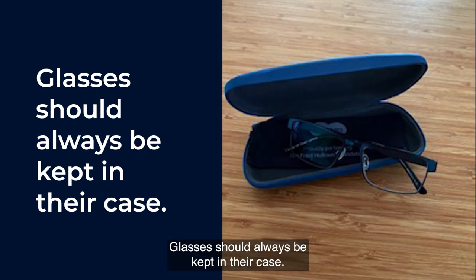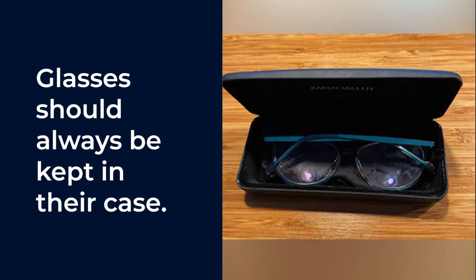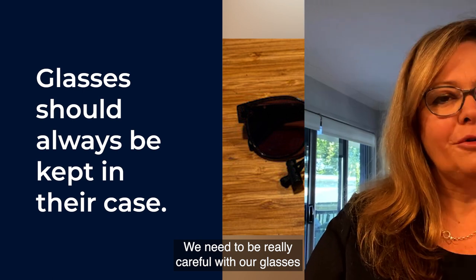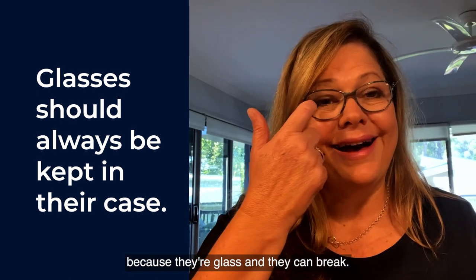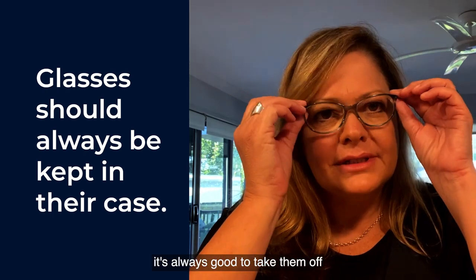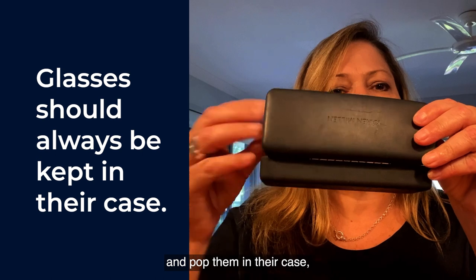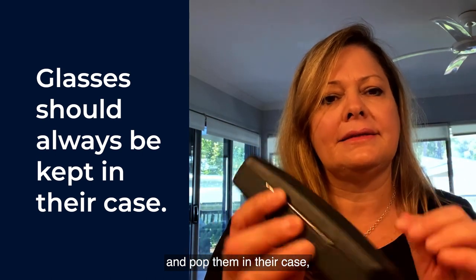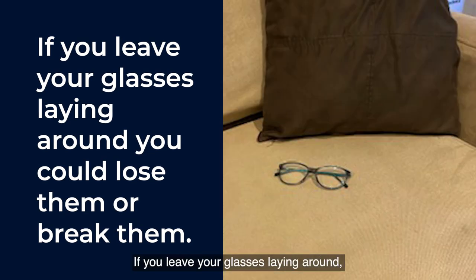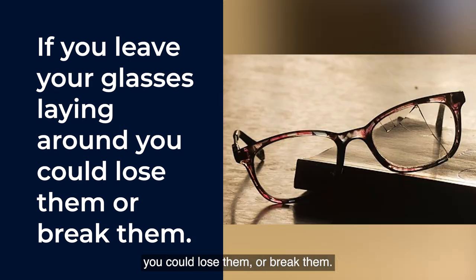Glasses should always be kept in their case. We need to be really careful with our glasses because they're glass and they can break. So when we're finished with our glasses, it's always good to take them off and pop them in their case so that they stay nice and safe. If you leave your glasses laying around, you could lose them or break them.